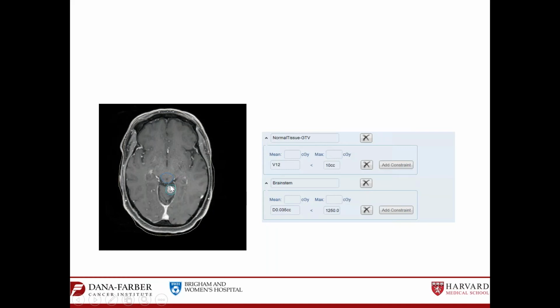But because it's beside the brainstem and you have some space between the brainstem for the fall off, you can push it a little bit higher, and you are just dealing with a little portion of the brainstem, the anterior part, not the whole thing at risk. You know what I mean? But if you're not sure of your setup error or your immobilization of the patient, and you're not sure of the actual brainstem dose that day, go ahead and fractionate the dose. Do 30 gray in 5, which is safer, or do 18 gray, okay?